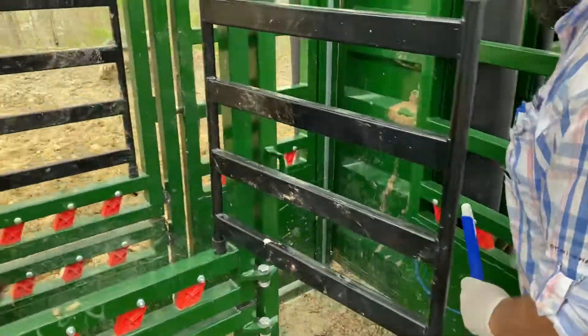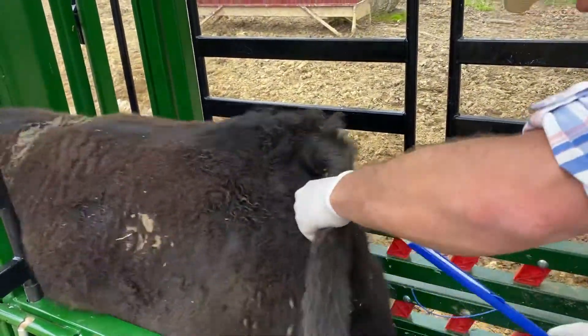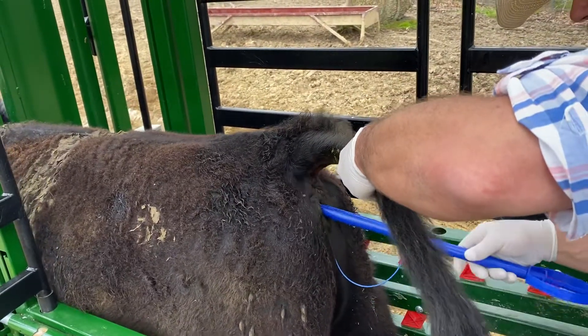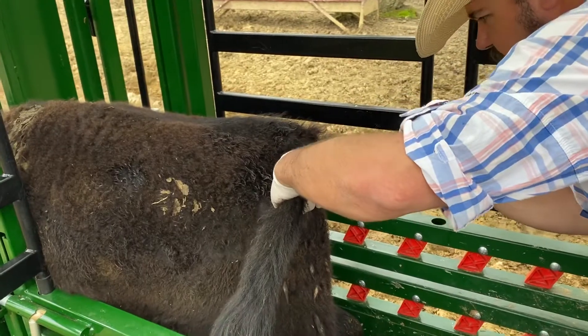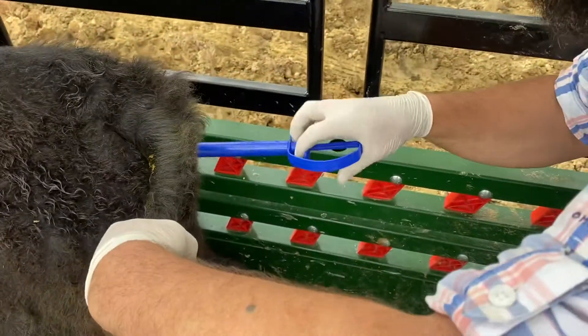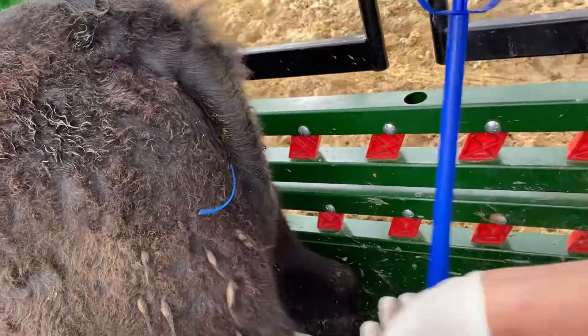I'm going to go over here to my heifer, get the tail and pull it over. I'm just going to slide it up and insert it up into the vagina — straight in like that. You kind of have to angle it up and over the ridge. I pop that lever and it's in there. The tail's turned down, and she's ready to go.